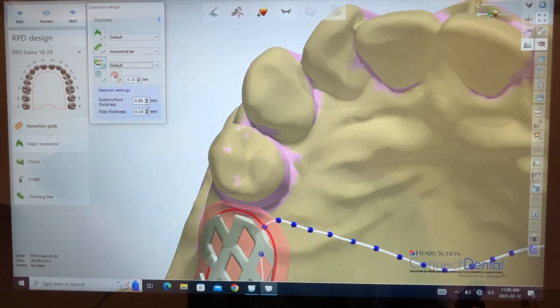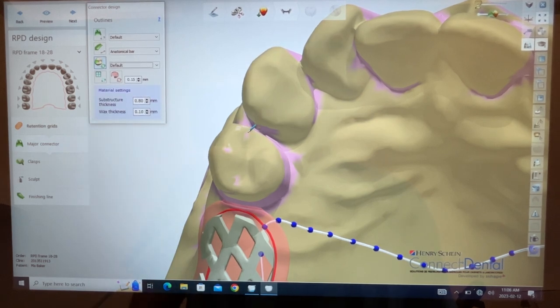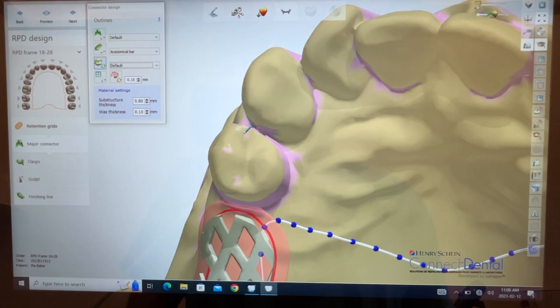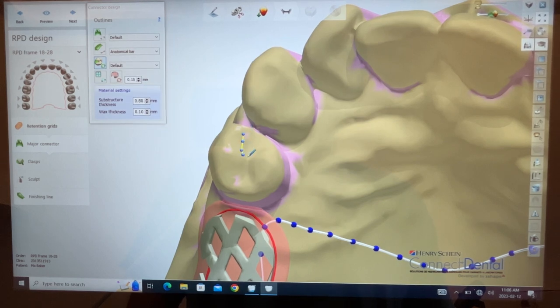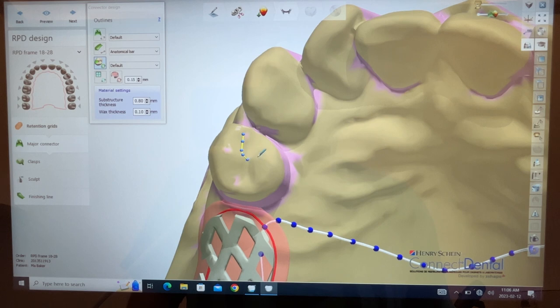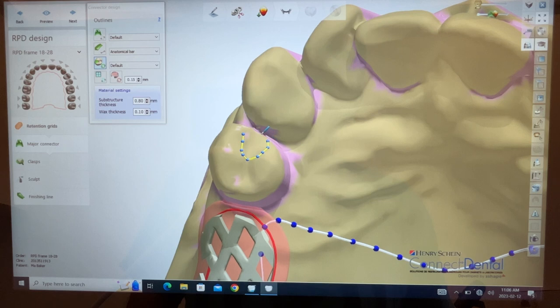There is a default here to the substructure thickness and the wax thickness. This needs to be played around. I'm going to outline the rest. Naturally, if you go over the margin of the rest you're going to have some trimming. If you go under the margin of the rest it'll be short.